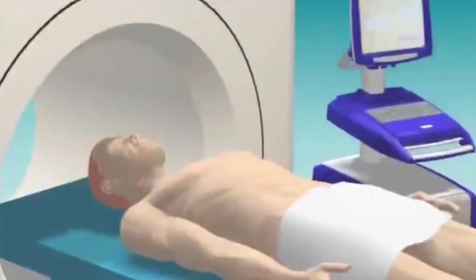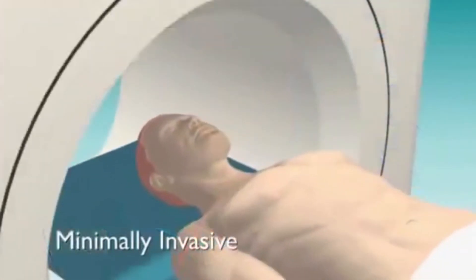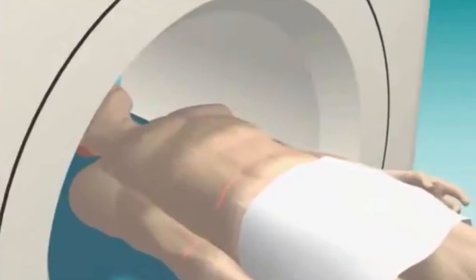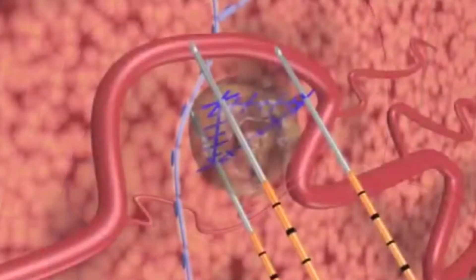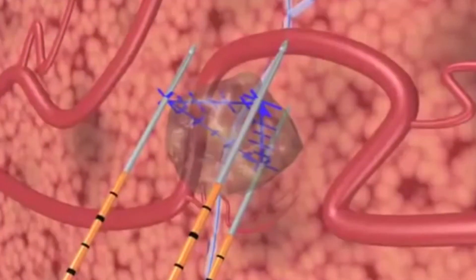NanoKnife IRE treatment is minimally invasive and is performed under general anesthesia with ultrasound or CT guidance. Preoperative imaging allows precise calculation of the tissue volume and shape to be treated, and aids the planning of appropriate positioning for the NanoKnife IRE electrodes.